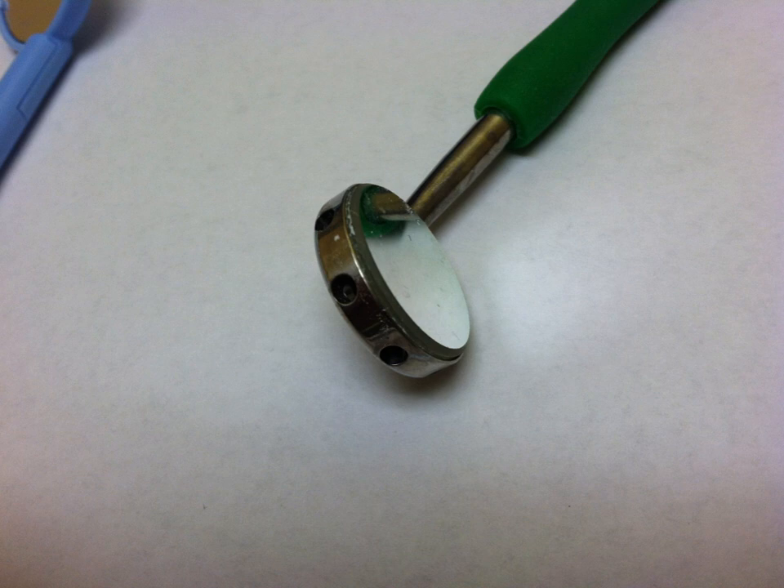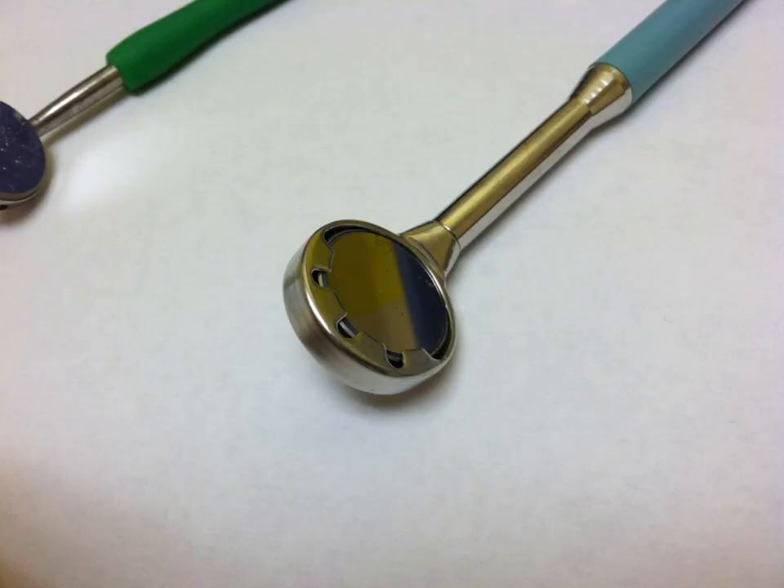This is the New Bird suction mirror. You'll notice it has holes on the face of the mirror, which is a big deal and we'll get into that more in a bit. There are no holes on the edge of it, but there are a bunch of holes on the back.